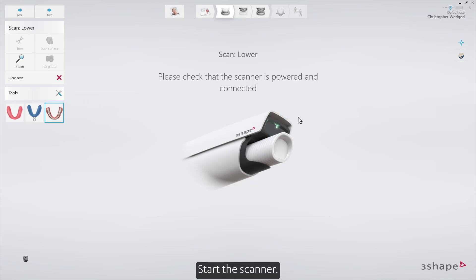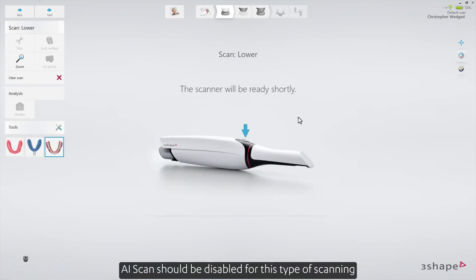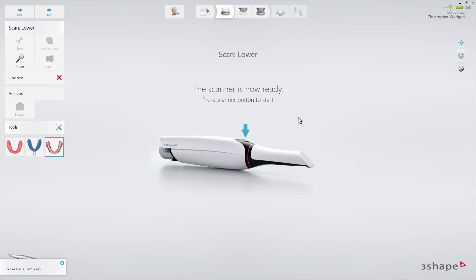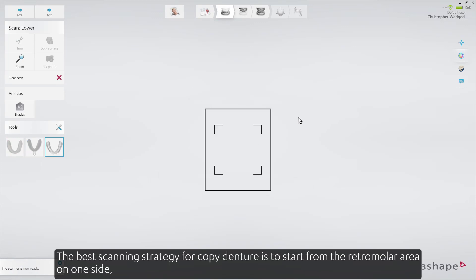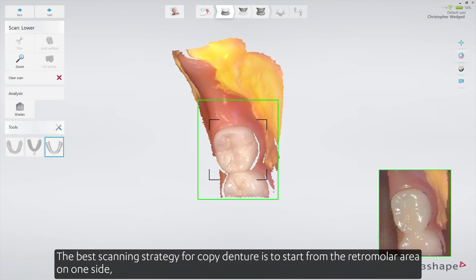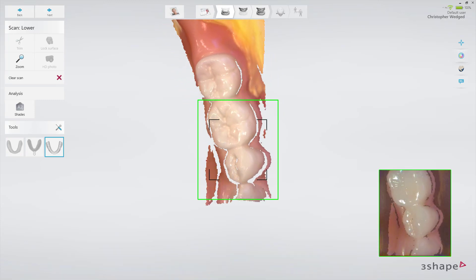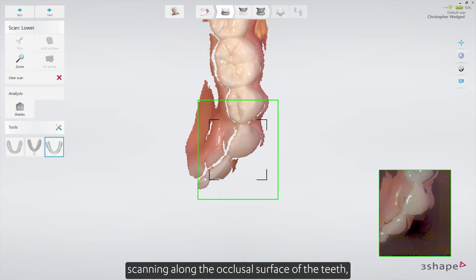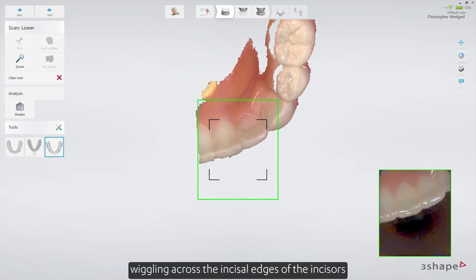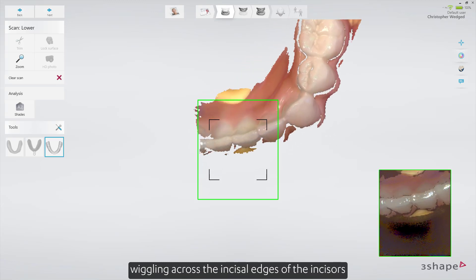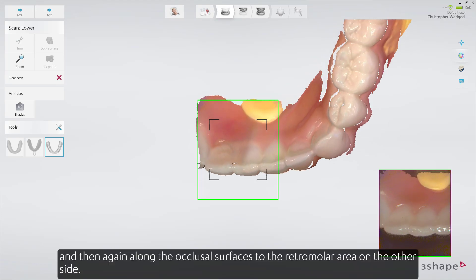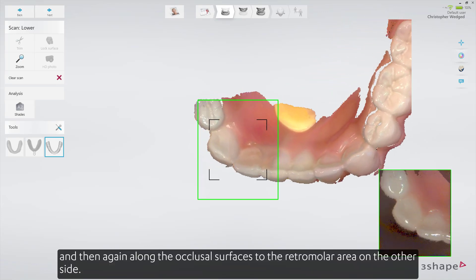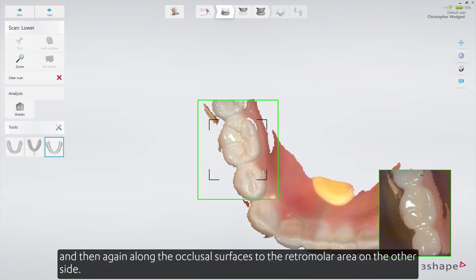Start the scanner. AI Scan should be disabled for this type of scanning. The best scanning strategy for a copied denture is to start from the retromolar area on one side, scanning along the occlusal surface of the teeth, wiggling across the incisal edges of the incisors, and then again along the occlusal surfaces of the retromolar area on the other side.